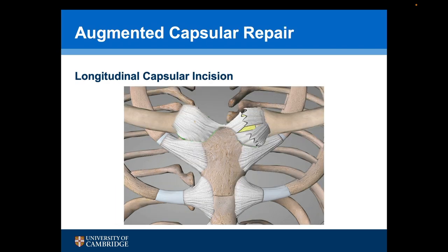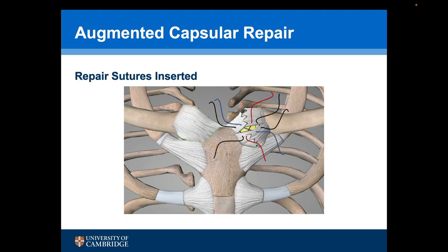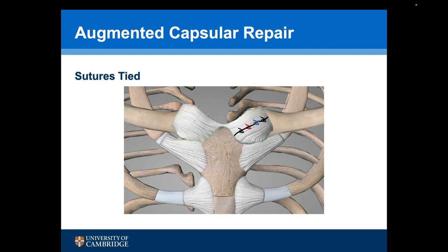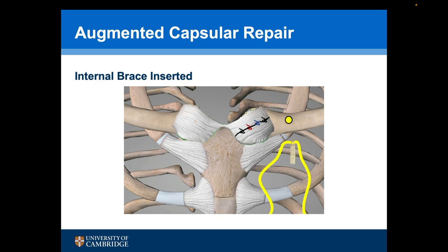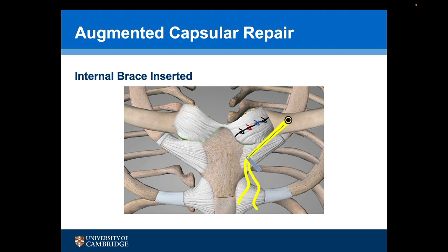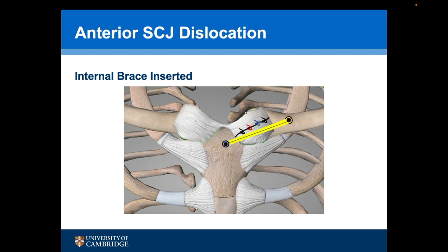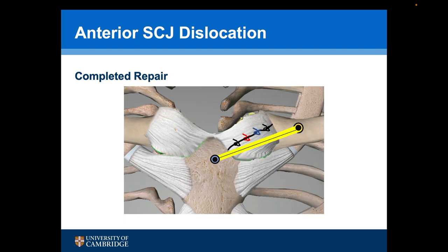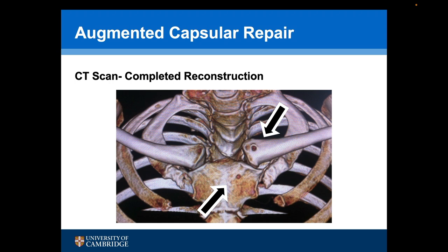The two sides of the torn ligament are then split longitudinally. Plication sutures are placed between the leaves of the capsule and then tied, repairing the capsule and also tensioning it. A drill hole is then made in the clavicle to accept the anchor from the augmentation device. The anchor is then inserted and the two tapes passed through a second anchor. A drill hole is then made in the sternum, the second anchor inserted, and the tapes between the two anchors tensioned, providing a strong construct to protect the repair. This is the completed repair. A post-operative CT scan shows that the joint has been reduced and we can see the two anchor holes for the internal brace device.